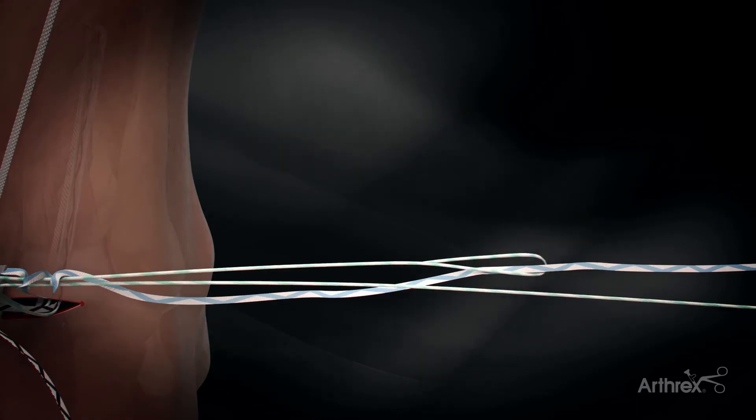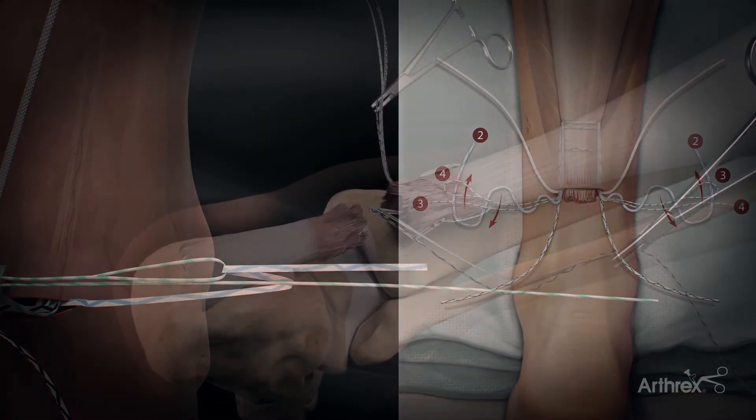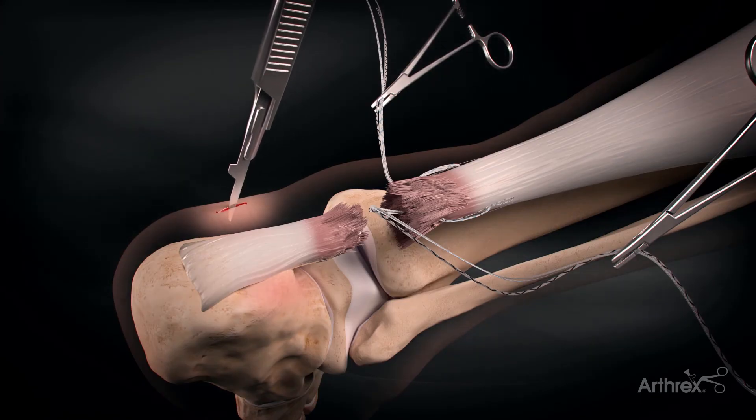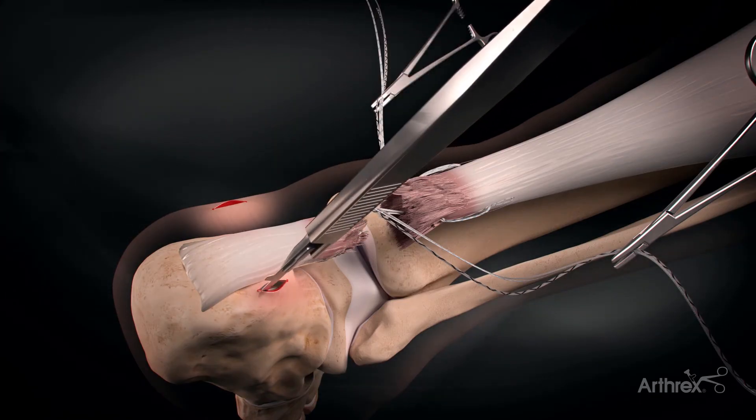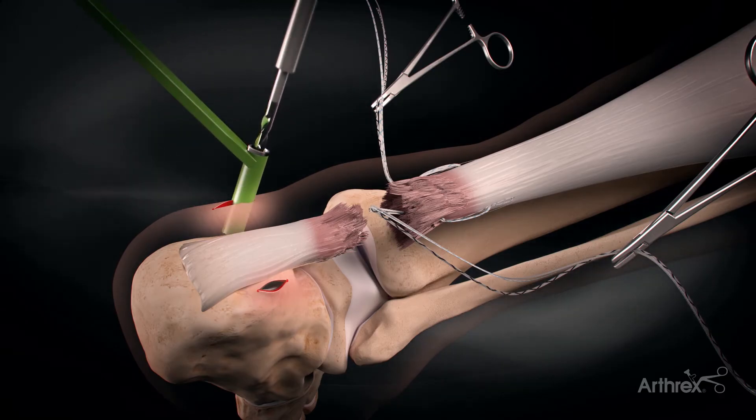Here we're just showing the locking stitch to create a capture of the proximal stump. Once the proximal Achilles stump is captured, we make two stab incisions onto the proximal calcaneus on the posterior aspect.